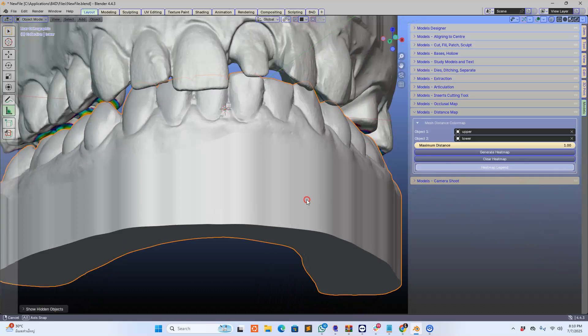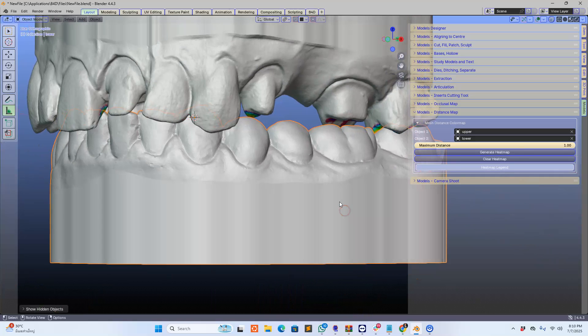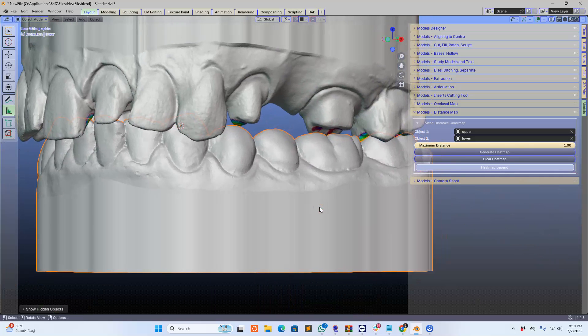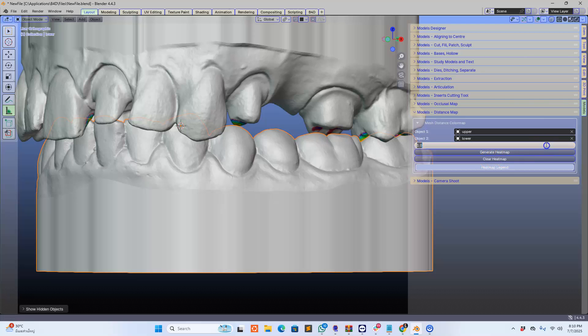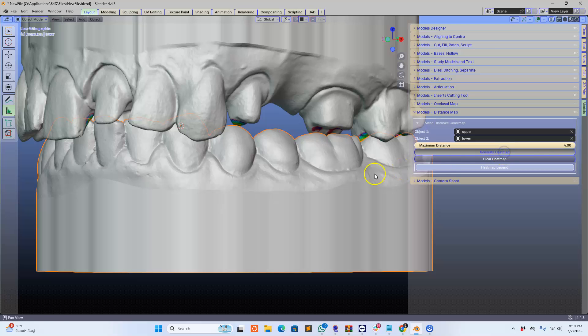Okay, now the beauty about this add-on is that we can change that. So let's put this to like four millimeters and click on generate.